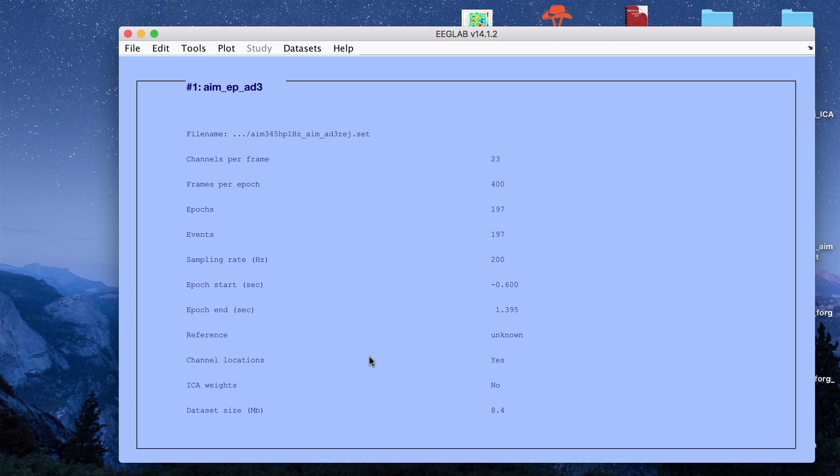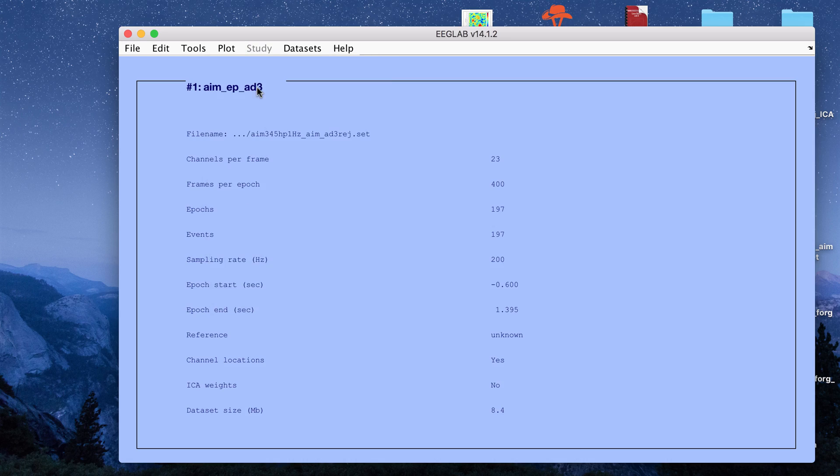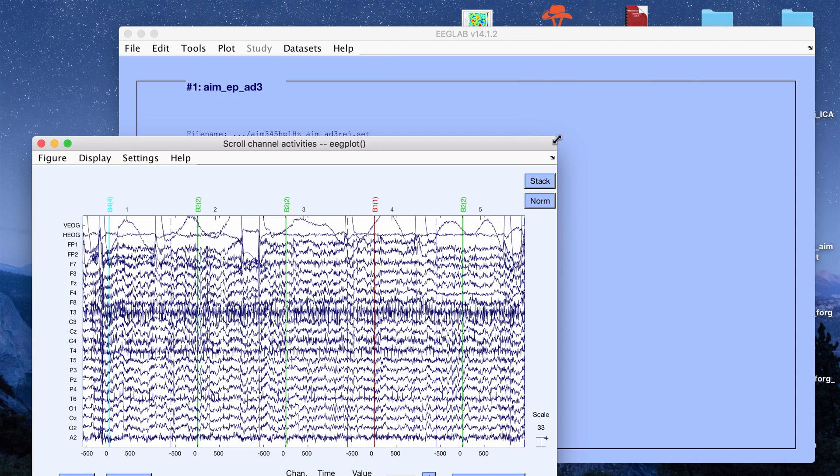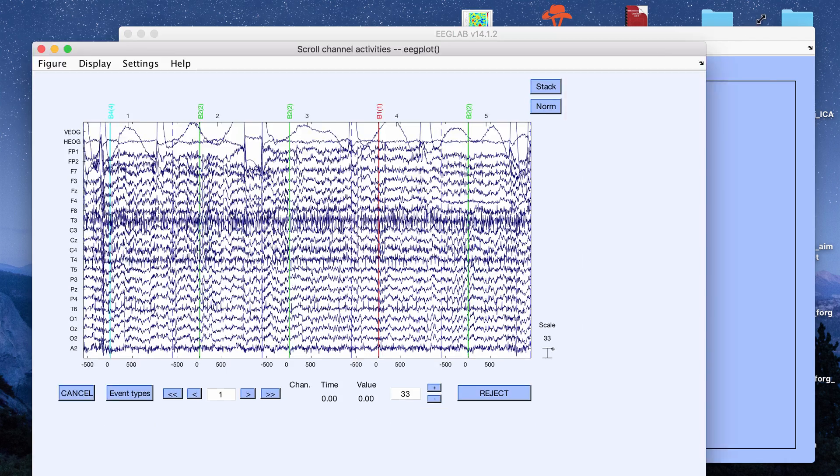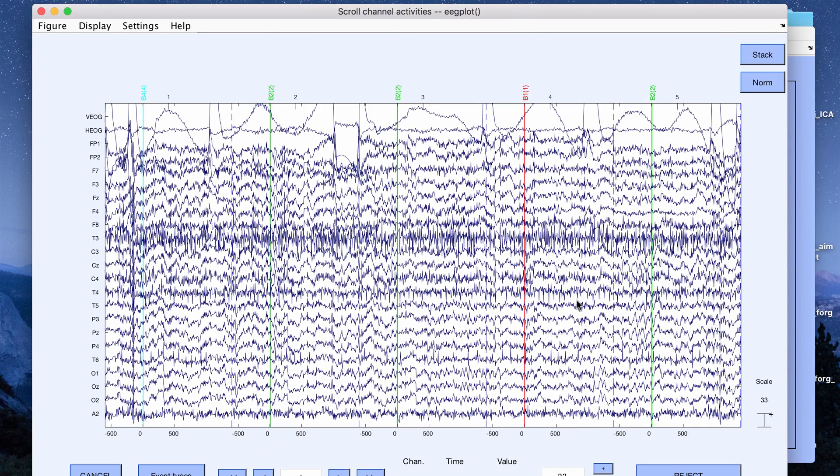Probably you're already familiar with EEGLAB if you work with EEG data, but it's a plugin for MATLAB. I already have a dataset loaded in and let me plot the channel data before running ICA just to show you what we're working with.